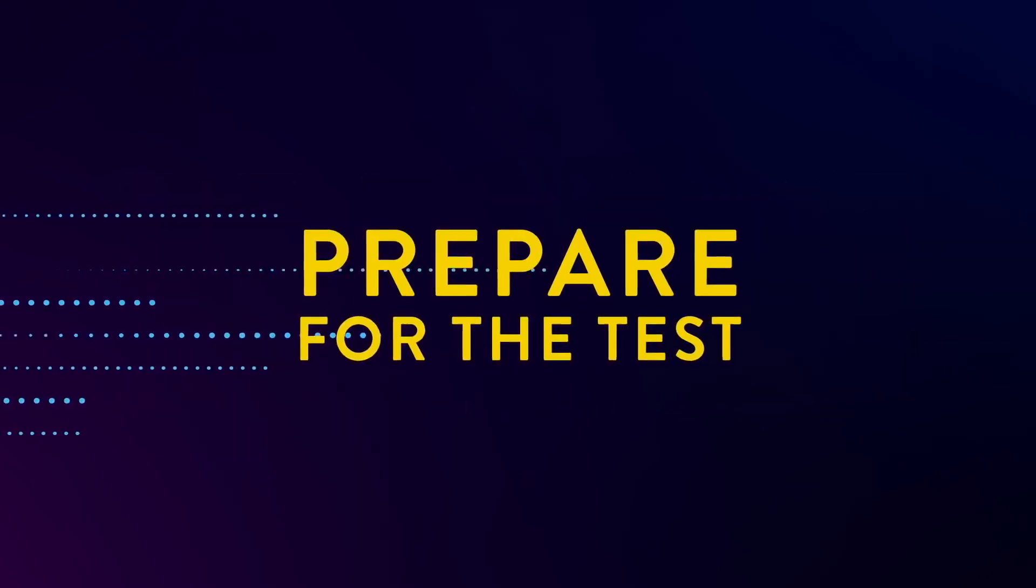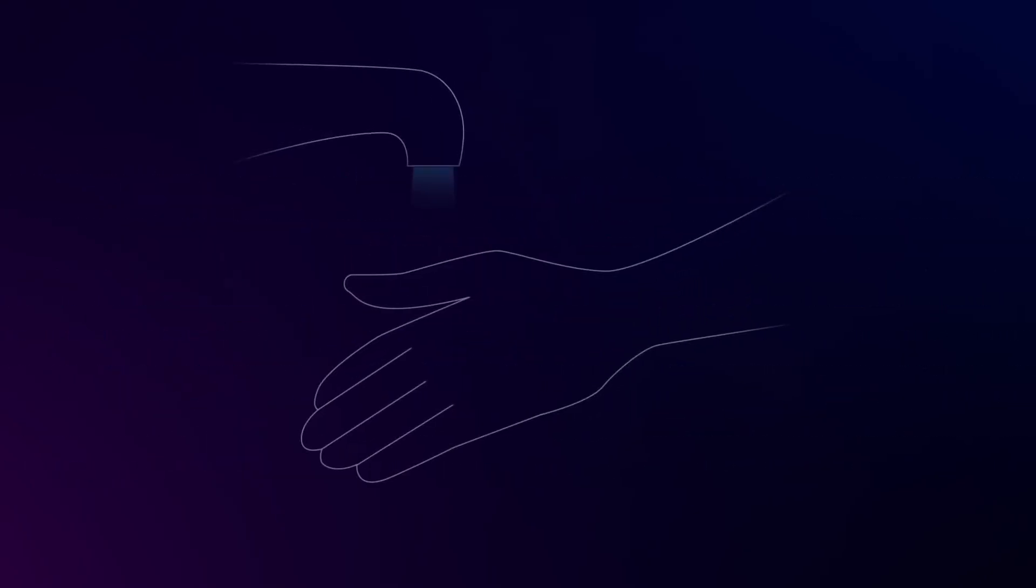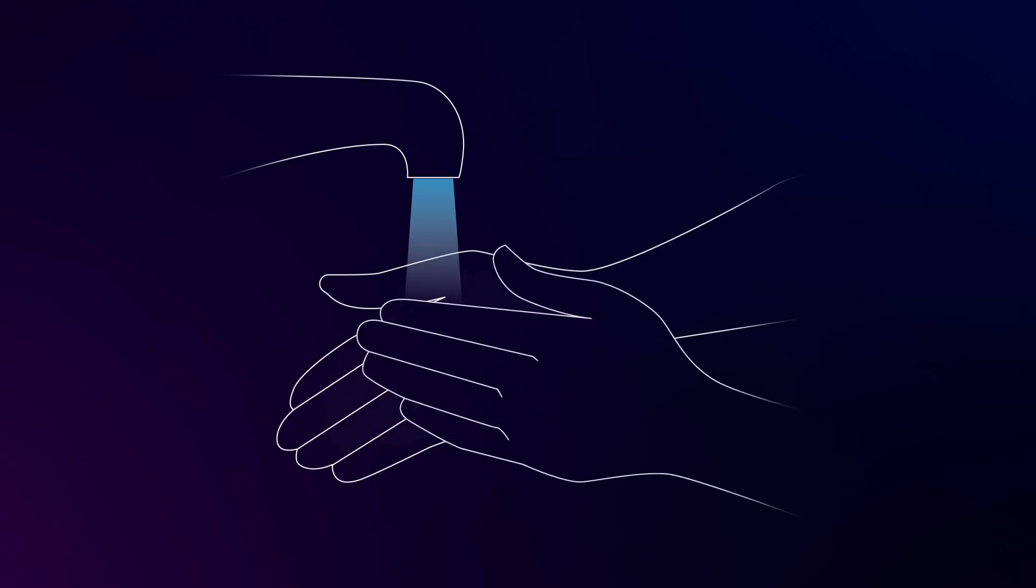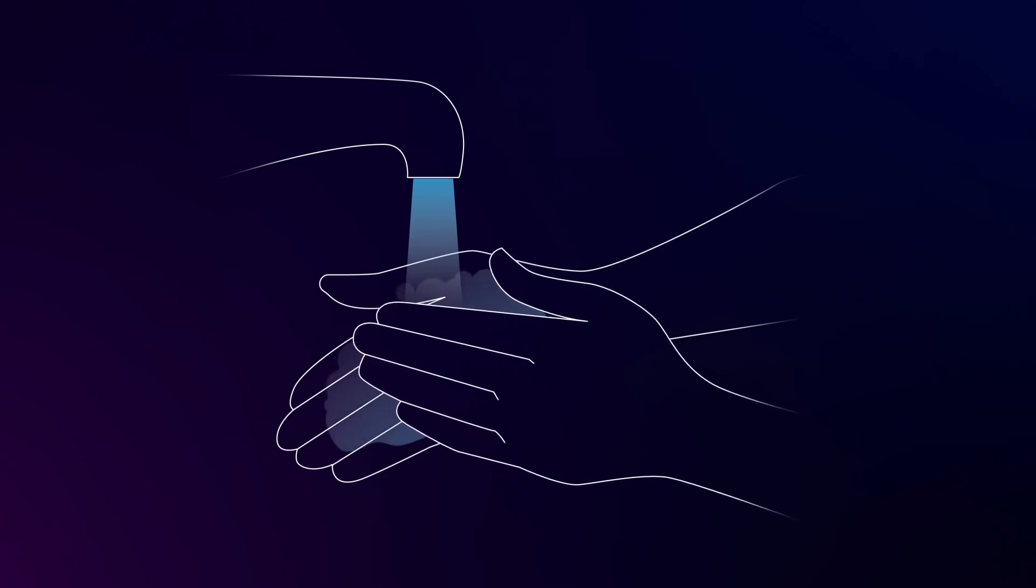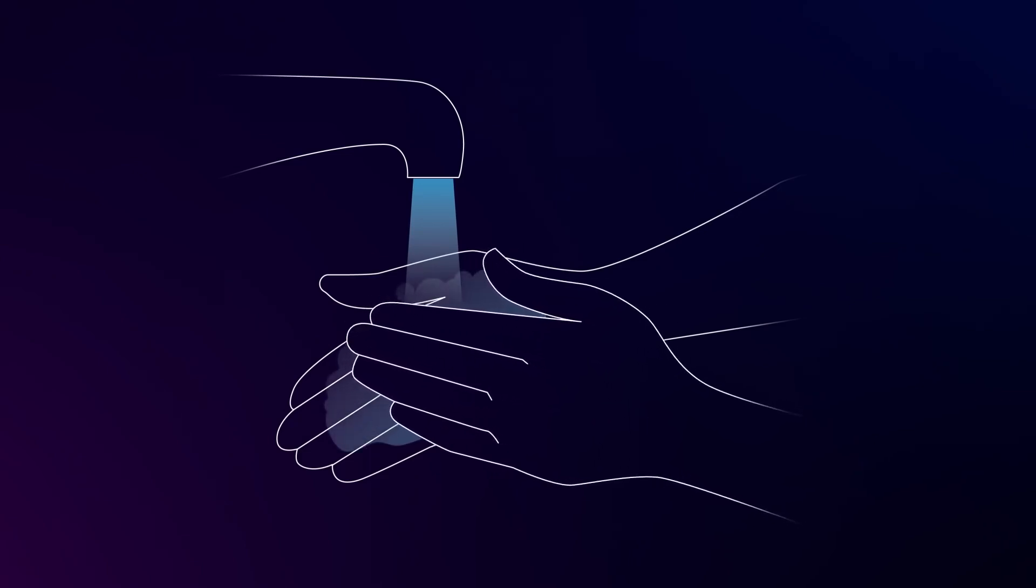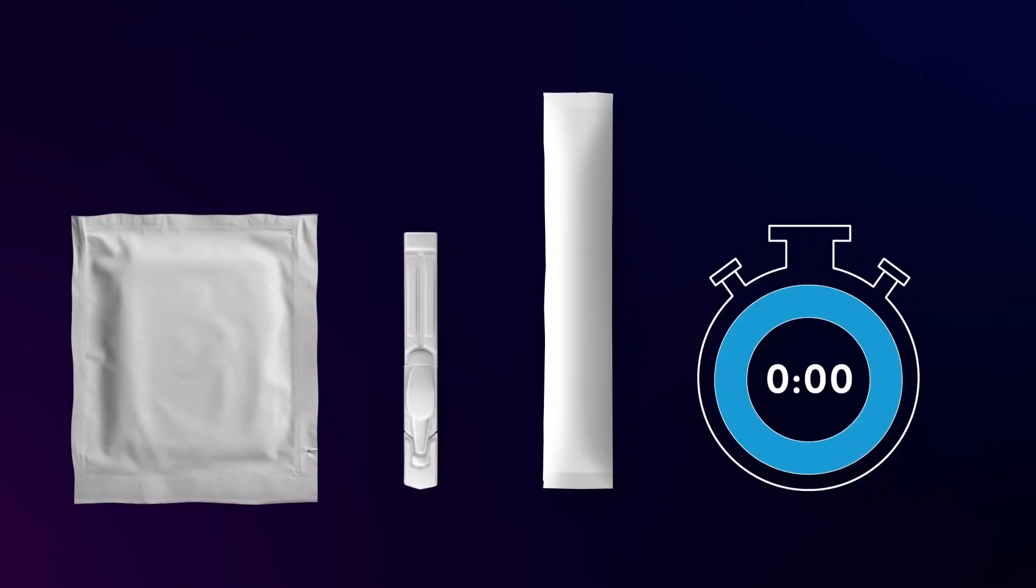First, prepare for the test. Wash or sanitize your hands. Make sure they are dry before starting. Take one test card, one dropper bottle, one swab, and your timer.